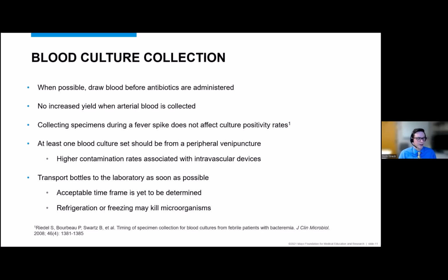We do also occasionally get questions about arterial versus venous blood collection and whether or not there's better performance in our blood culture assays depending on what is collected. There have been multiple studies that have really shown that there is no difference. And because of the complications associated with arterial blood, and also given the fact that there's actually been increased reports of blood culture contamination with this collection, we recommend venous blood. The performance of that is going to be as good as arterial blood collection, so that is not necessary.